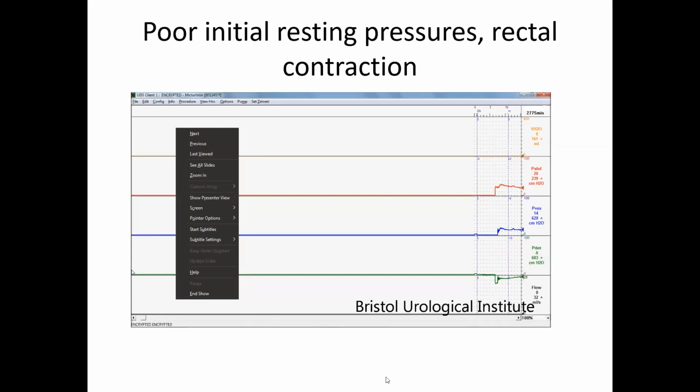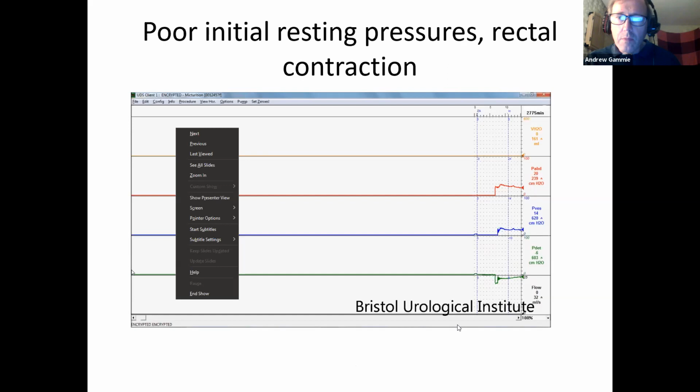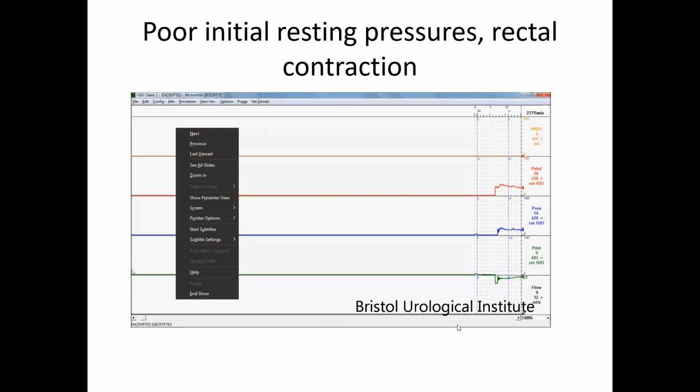This is really mean. I'm just going to go through the list. Oh, okay, Courtney, fantastic. Thank you. You're right. The vesicle line is making me feel a little bit anxious, and I'm glad it is for the rest of them. Therefore, what would you do? So if you've noticed that the vesicle line is reading slightly under, what would be the initial action that you would take?